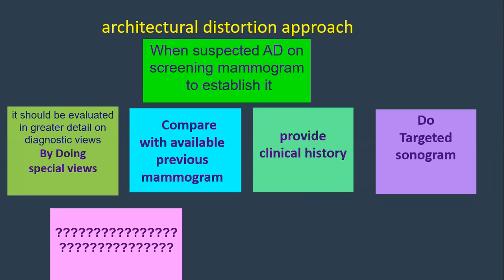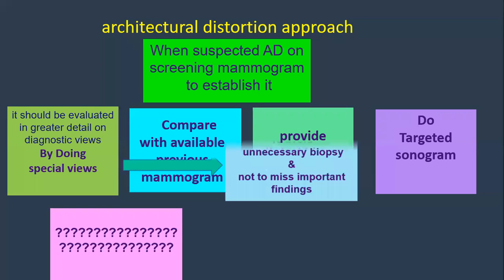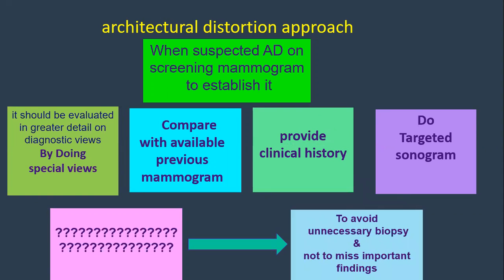Yes. So you're right. Any other suggestion? We have to take a biopsy. So before taking a biopsy, we have to make sure that, to avoid unnecessary biopsy and not to miss important findings.